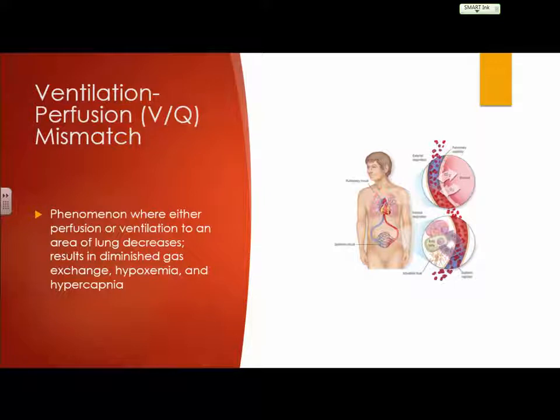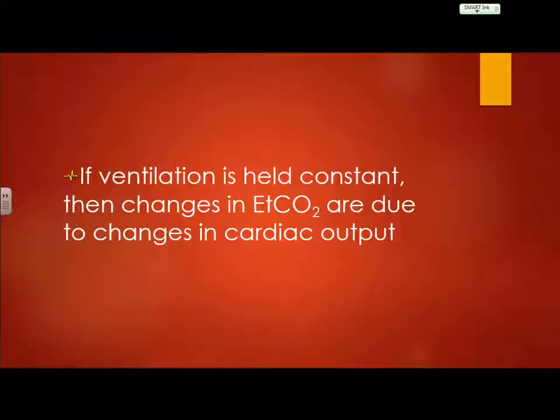Again, just like with anything else, CO2 monitoring is a useful diagnostic tool, but you still have to look at your overall patient presentation. Okay? If ventilation is held constant, then changes in end-tidal CO2 are due to changes in cardiac output. What I just explained, summed up in one statement: if you are ventilating at a rate of 12, good tidal volume, good chest rise and fall, but then you notice that your CO2 levels are changing, based off of what has previously happened to the patient, why you're intubating the patient in the first place, that's probably going to be the underlying cause of your changes in CO2.